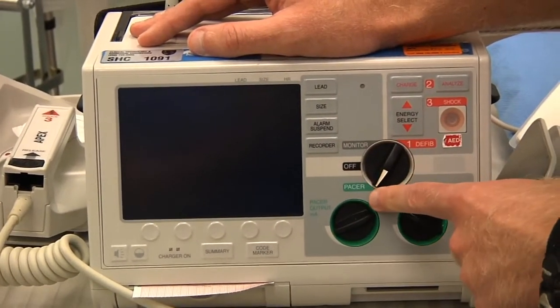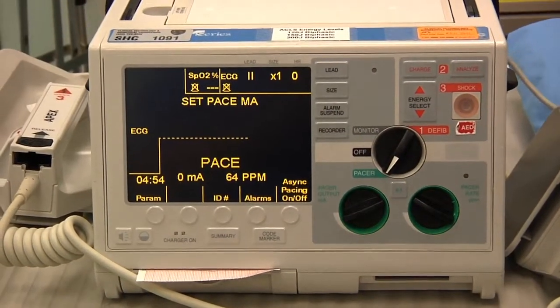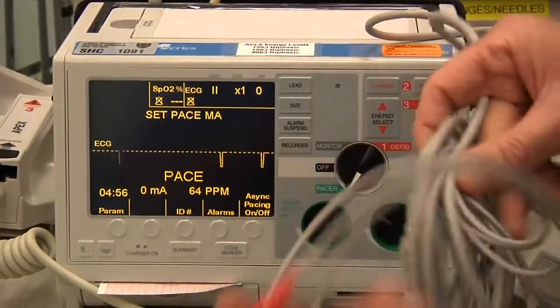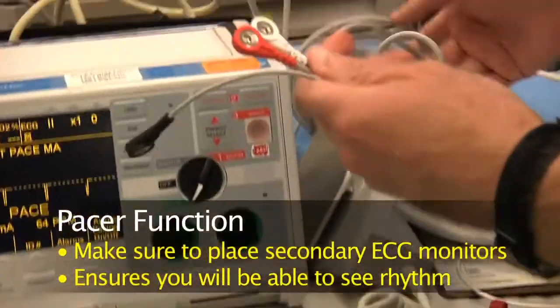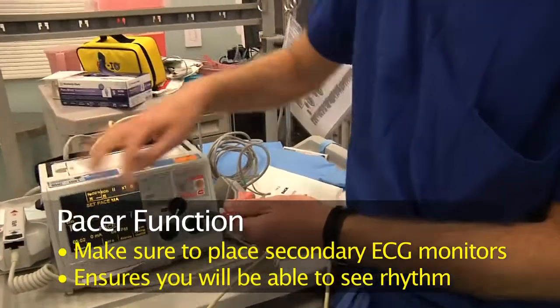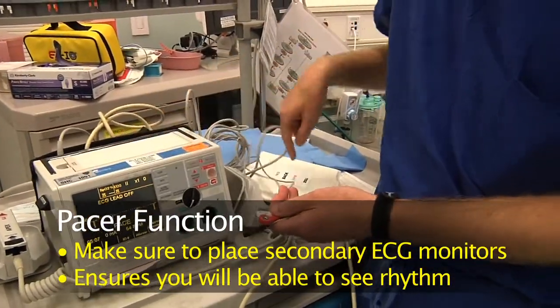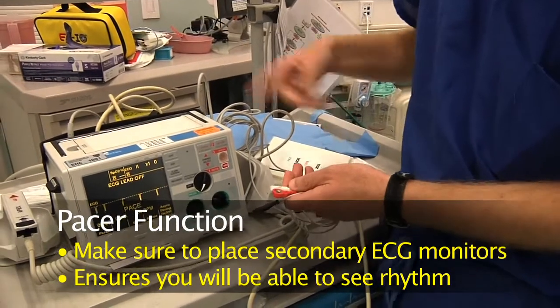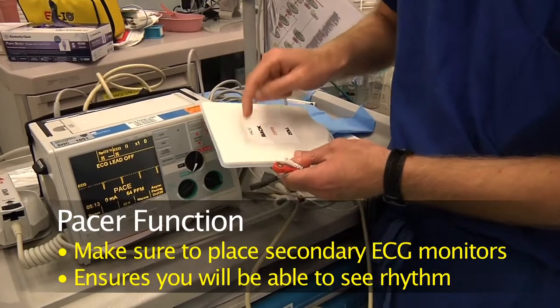The other important thing about the pacer is if you don't hook up the secondary ECG, so all pacer defibrillators have ECG cables. If you don't hook these up, then you're not going to be able to see what the rhythm is, because these pads can either send or receive. They can't do both. So when the pacer is active, the energy is going out, it can't interpret what the rhythm is.